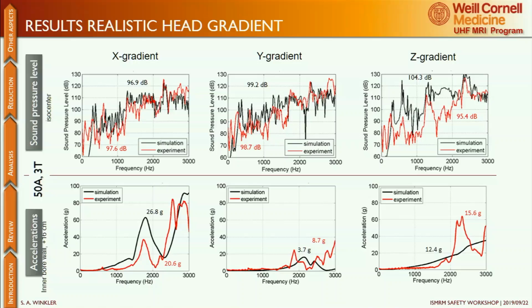We thought that this was a video too, which is kind of a shame because it illustrates things so nicely. But if you just look at the standalone gradient coil, basically the energy in here is mostly resonating, so it pulsates. Now, if you actually find a way to get all that energy out of the gradient coil, then it won't be so loud in there. So it's a little bit like an antenna or a horn where you can get your acoustic energy on the outside. In a way, it's impedance matching between the impedance on the inside and the free space impedance on the outside. It wasn't a dramatic effect, but we got a little bit of a reduction, so a few dB.